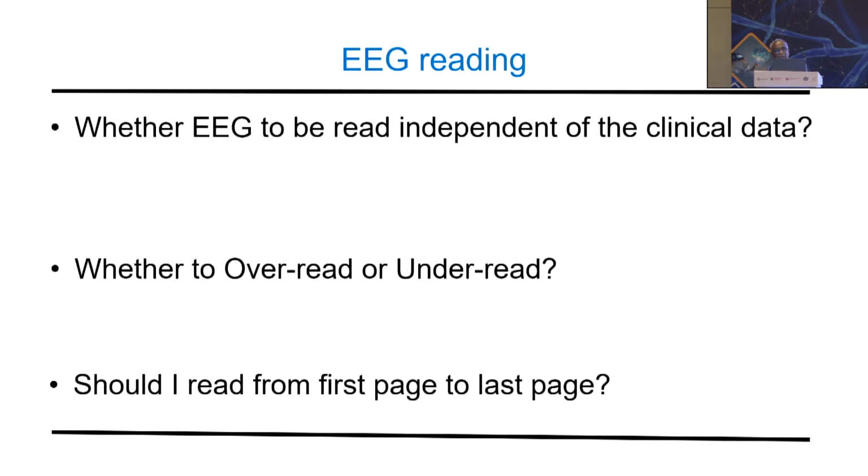But the problem with that, as we discussed briefly in the morning, is that you may be biased. For example, if somebody has mentioned that they strongly suspect an epilepsy, then, because all of us are human beings, there may be a tendency to make even a benign epileptiform pattern epileptiform. Ultimately, the clinical diagnosis may not be exactly what it was meant for.